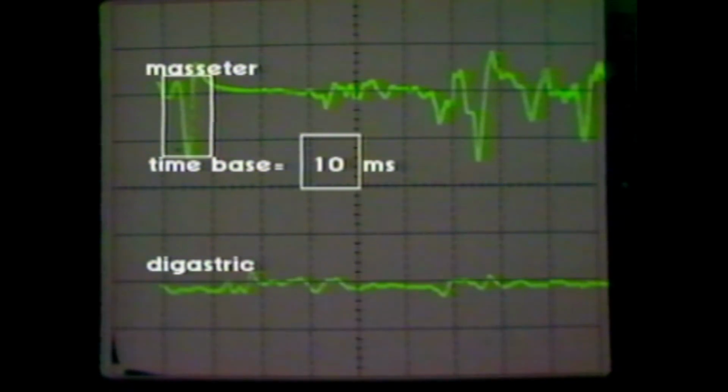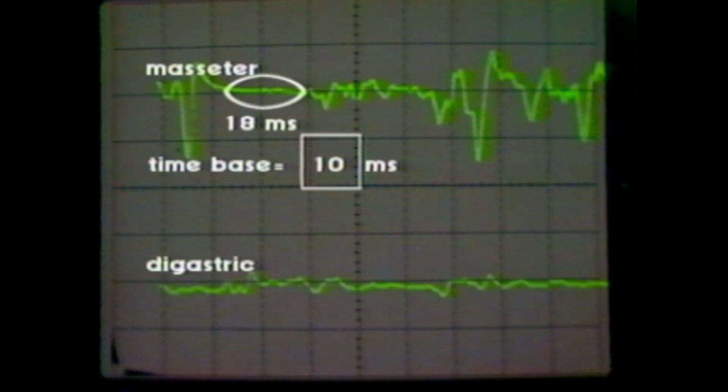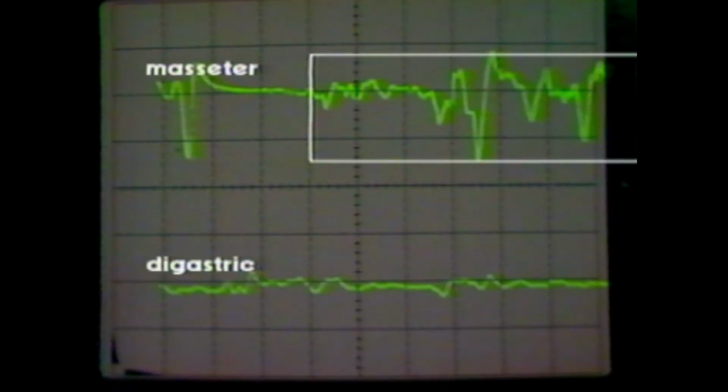Motor units are recruited as seen by the synchronous wave, followed by a silent period of motor neuron and motor unit inhibition for 18 milliseconds. The time base is a 10 millisecond division. After the silent period, asynchronous activity is recorded.